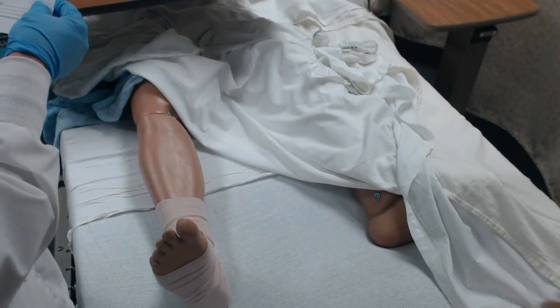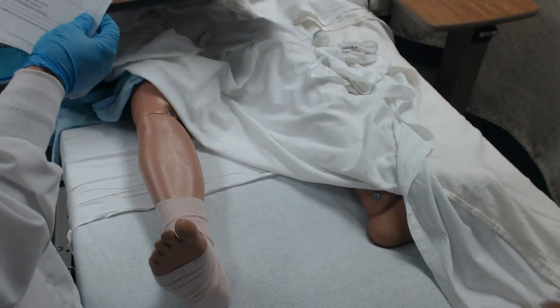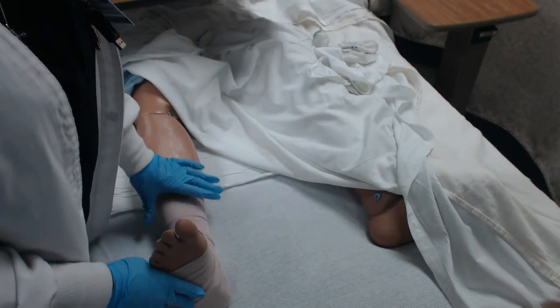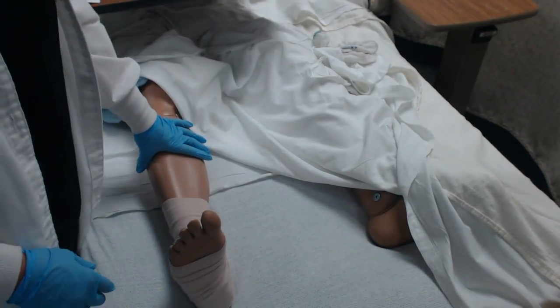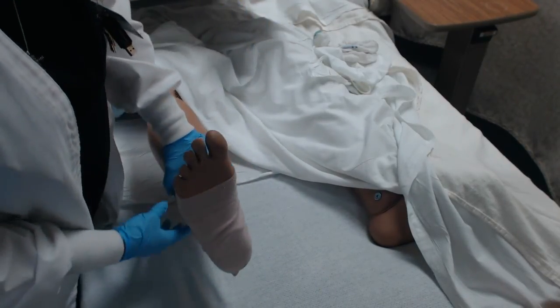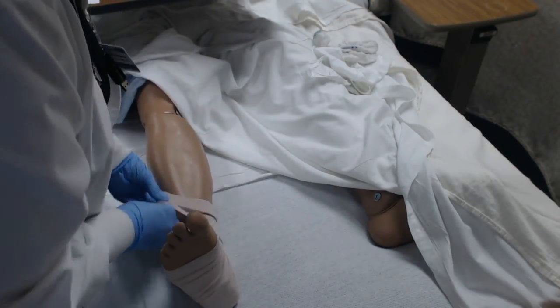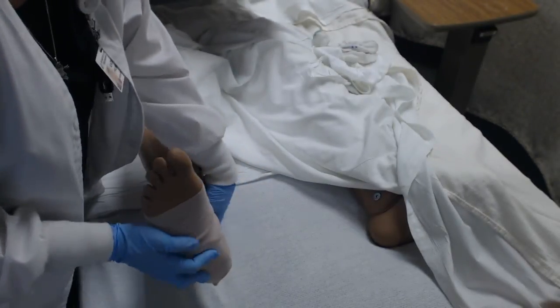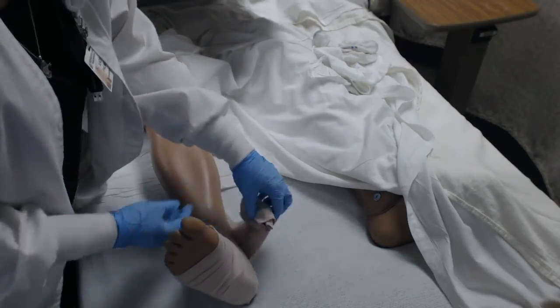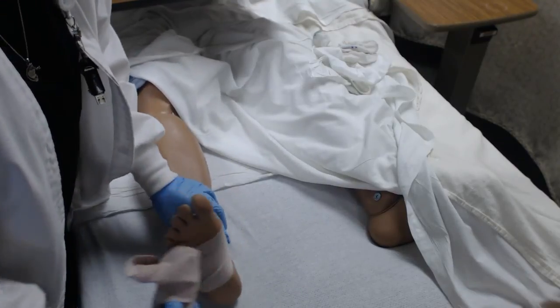The only other thing I want to make sure that I cover with you is if you were to have a patient with an amputated extremity, especially if it's a fresh amputation. And let me just pull this off and I'll show you how we get it off. We just kind of wrap around the patient. And you may need somebody to help you hold the leg of the patient, especially if it's really, really edematous or filled with fluid.